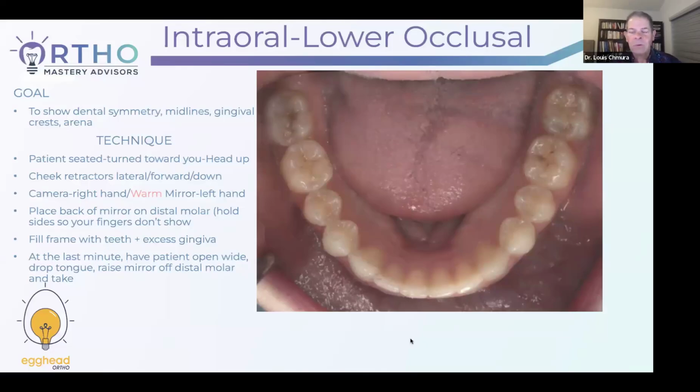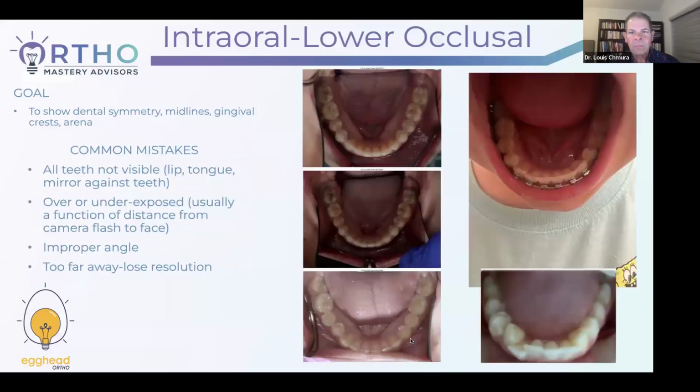You sit down, you get them oriented, you put the mirror in, but you hold it up against the upper teeth, and there you get it as comfortable as you can, get it focused, get it ready, then say, I want you to open real wide, do your final adjustment really quickly, and snap the photo right now, okay? You don't want them in that position for a long time. It's awkward for them, and then it becomes awkward for you.